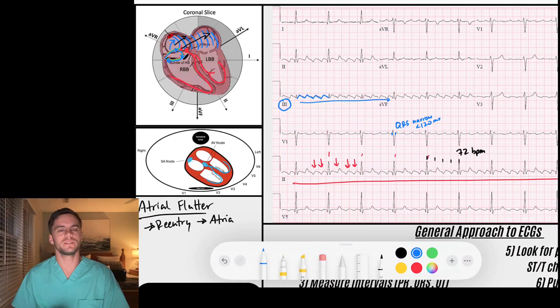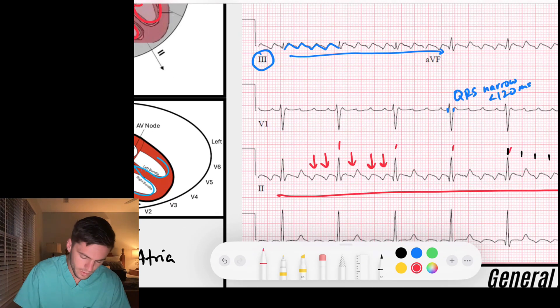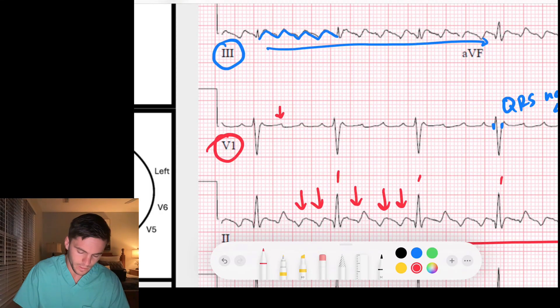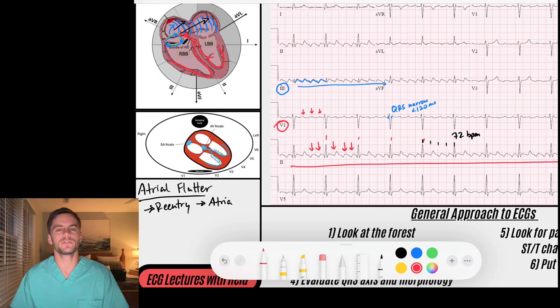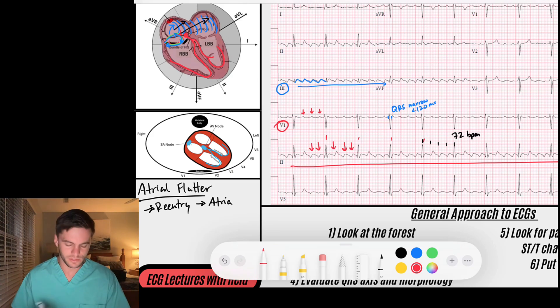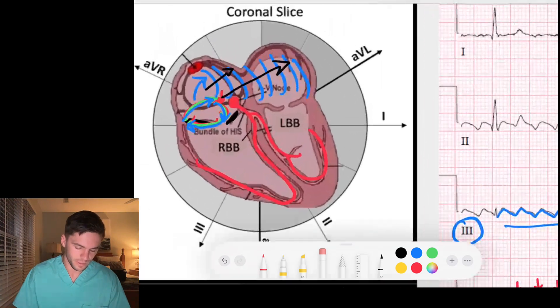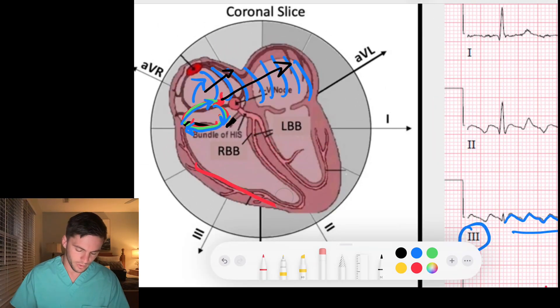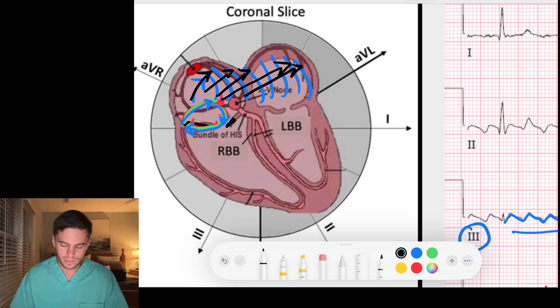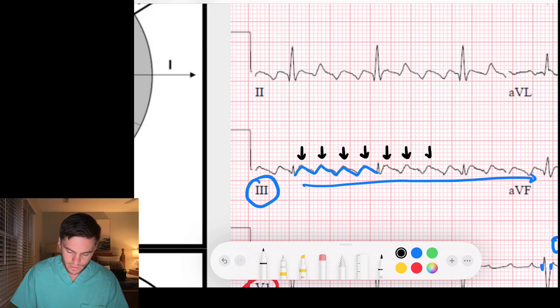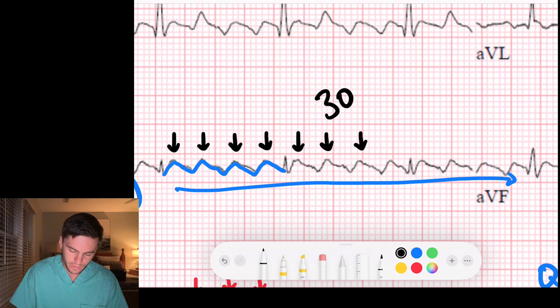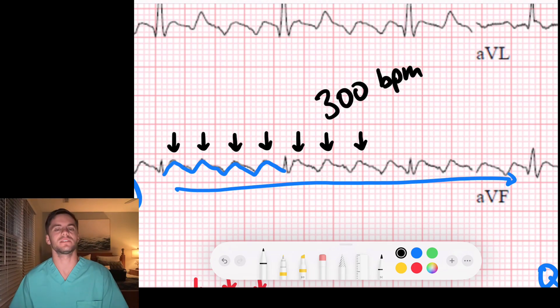Now that we suspect atrial flutter, look at V1 — it always has really nice, sharp flutter waves. These flutter waves, if I count their rate, are occurring at about 300 beats per minute. That is a very fast flutter wave. So signals are going around the tricuspid annulus at 300 beats per minute. Normally atrial flutter occurs anywhere between 250 and 300 beats per minute, so we're right in that range.